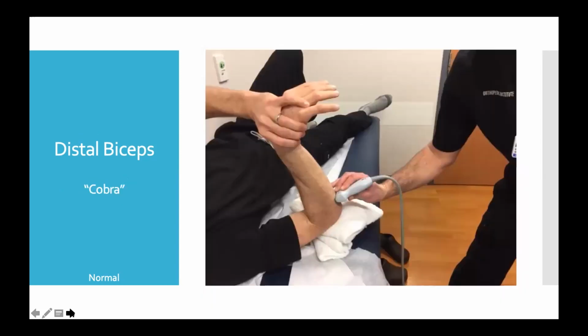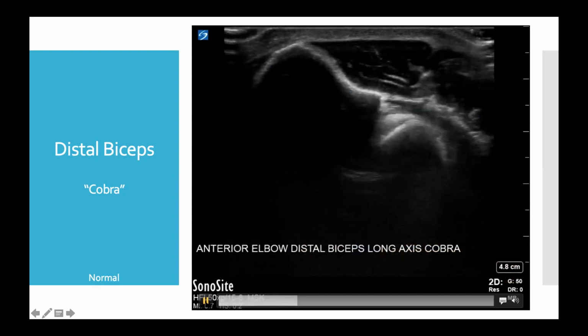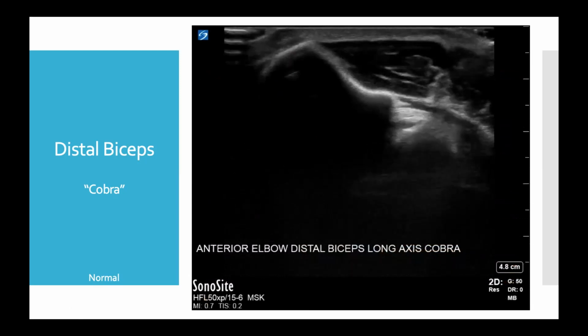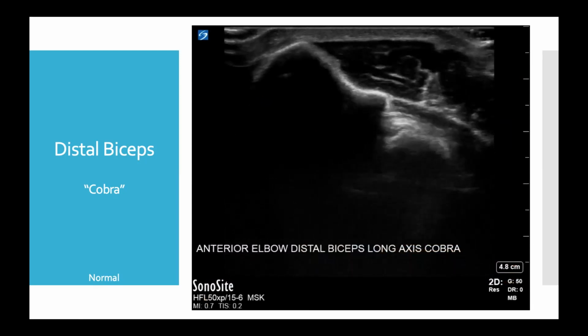The second window is called the Cobra, and you have the patient flex the elbow, fully pronate, and then flex the wrist as well. And again, you're looking head on, it's almost like a posterior elbow view. What you're looking for is the insertion of the distal biceps on the radial tuberosity as it lies adjacent to the ulna here. As the patient supinates and pronates, we can see the insertion come into window. And again, this is just an added evaluation in more of a dynamic state.